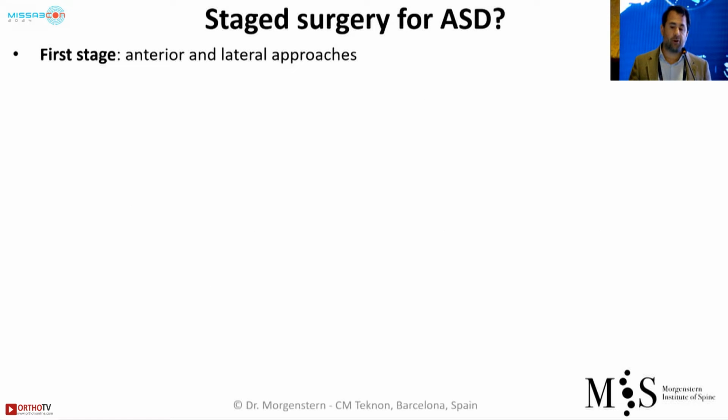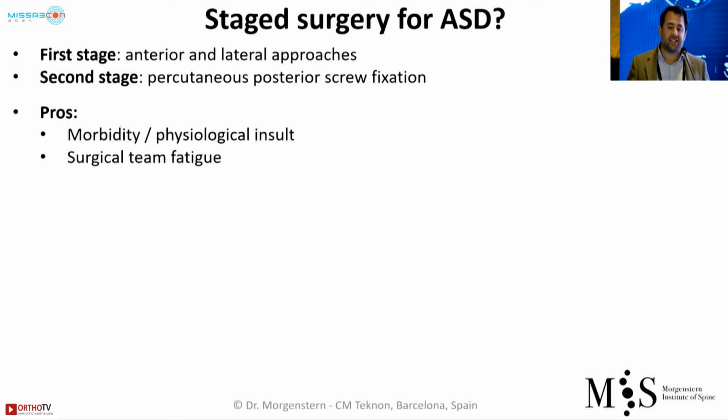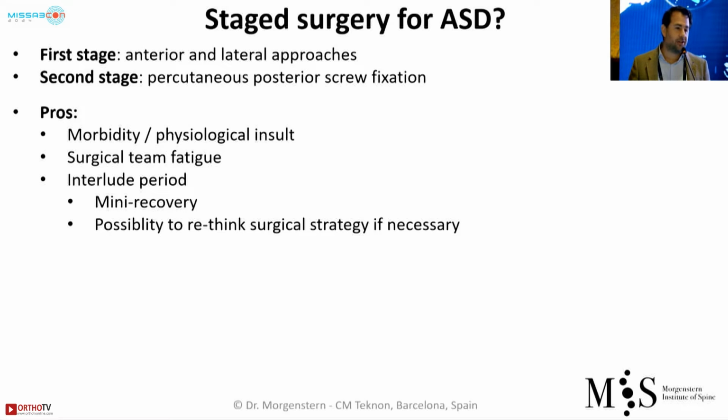And then, of course, the percutaneous screws. Well, you heard the talk before. Usually you want to stage this kind of procedure. In the first stage you will do your anterior approaches, in the second stage you will go posteriorly. Of course this is good for the patient. You have less insult in one session. The surgical team will not be that fatigued.